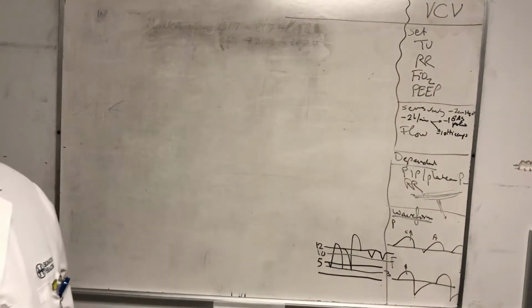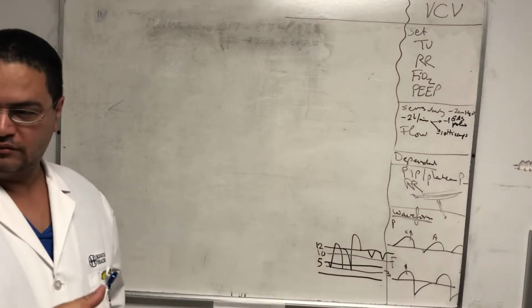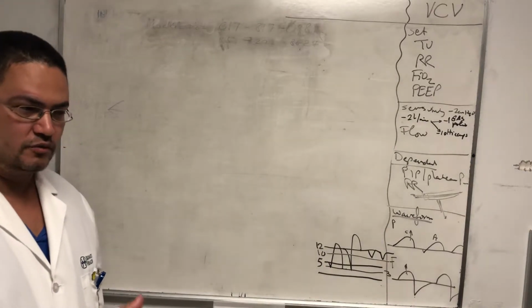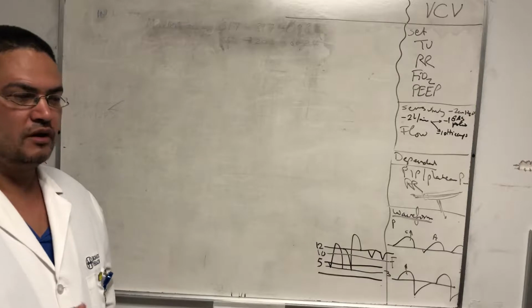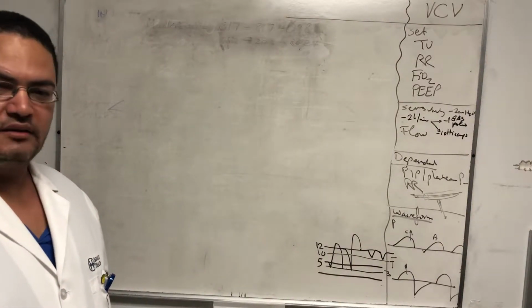It can, and a lot of other things can trigger the vent. Water condensation, if you're using water for condensation. We used to use a lot of water before. If it puddles in the lower part of the tube, it can actually move a little bit and trigger the vent. Sometimes abdominal movement.